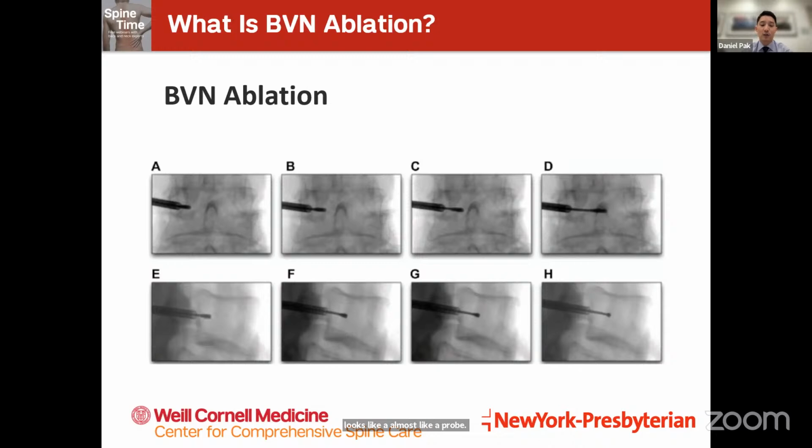And again, this is really just to demonstrate the things that we're looking at when we're doing this. And these are instruments that are pretty small. That's the reason why we can do this as an outpatient, under really minimal sedation, and then also have a quick recovery period afterwards.